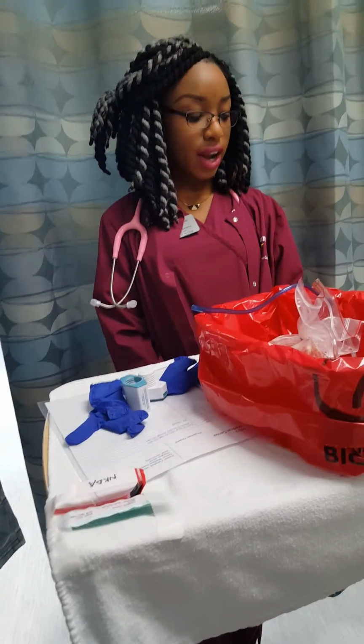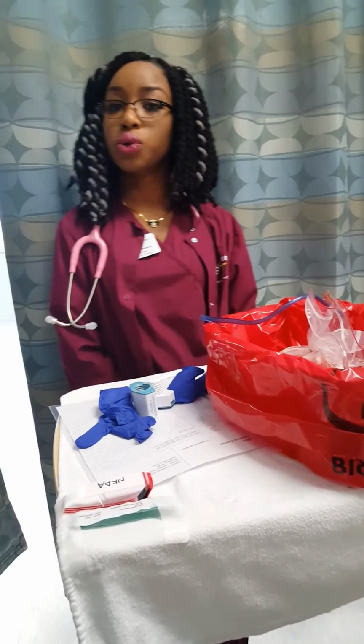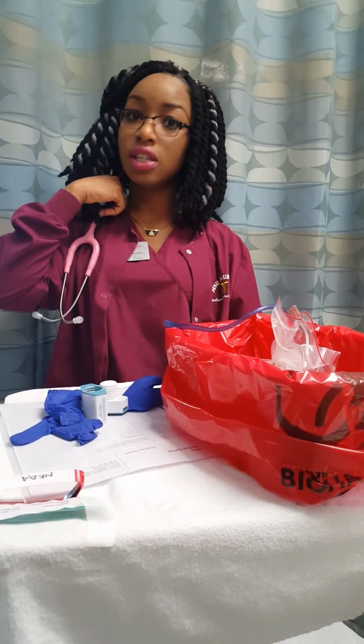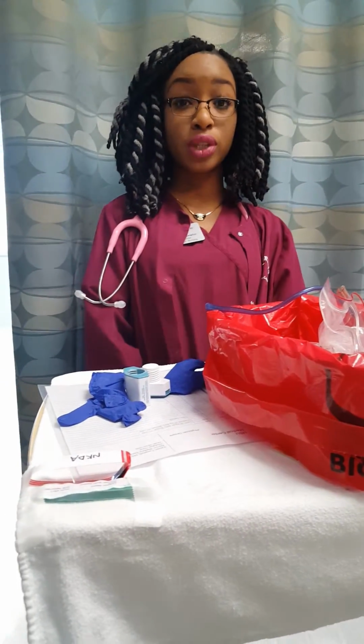We need to lock it. Where's the locking stuff? Alright, I will be giving my patient his medication, Lasix and Lotensin. Lasix is just for his edema, so it's a diuretic medication just to take away the excess fluid. And the Lotensin is an ACE inhibitor to lower his blood pressure because he's a little hypertensive.